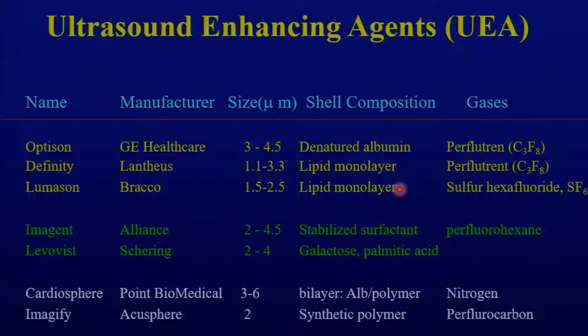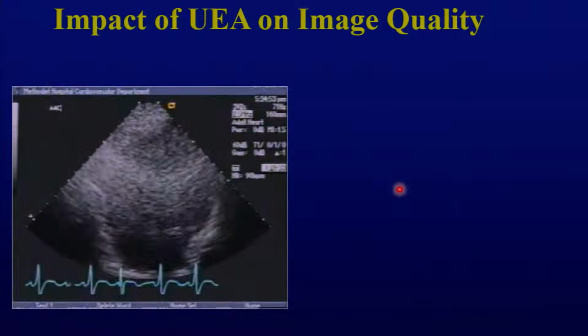Early on, the uptake of utilization was very, very slow. Nowadays, much better than before, and it took a lot of education to assess and validate the impact of such agents in our day-to-day practice. The major indication is enhancement of evaluation of left ventricular function. That's the only indication nowadays approved by the FDA. If you have 2 or more segments of the heart that you're not seeing, that you need to see for whatever reason, mostly evaluation of regional and global function, that's what you would do.